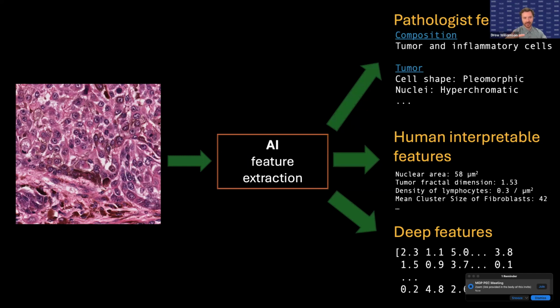Certainly some combination of them could, in theory, capture that, like maybe the color difference between this region of stroma and a region of normal stroma elsewhere, and maybe the length of the collagen fibrils or something like that. So I think in theory it's possible to do the conversion you're talking about. I think maybe today in 2024, with the data sets that we have been able to assemble, it's easier to do the entirely black box thing and get more reasonable results.